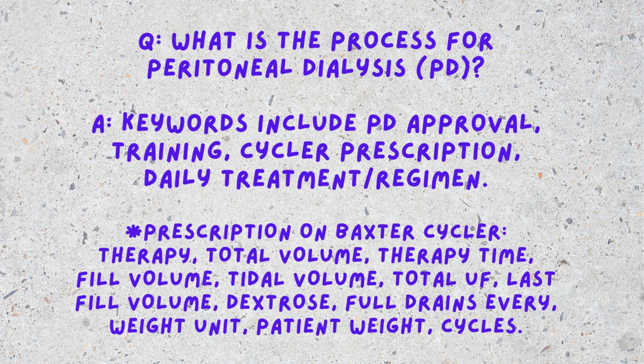Then there are other cycler settings. That's for the machine that you could set, and that would be like date, time. You could also set like the brightness of the display. You could set like the sound level. For example, if you're setting your machine up, like the prompts to do this and that, because usually when you set your machine up, you want to set it up at least 30 minutes to an hour before you get on the machine. Now, some people can do it maybe in the morning when they are done taking it down. That's also fine if that works for you.